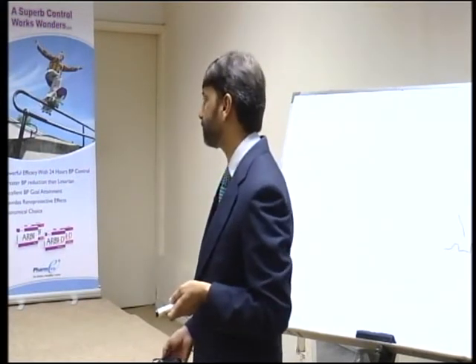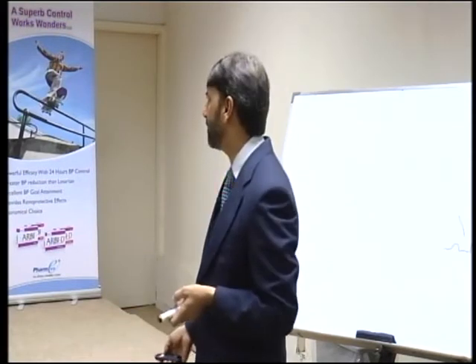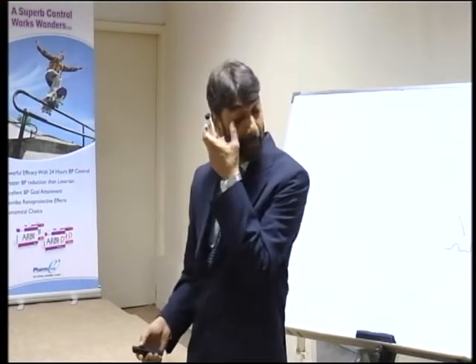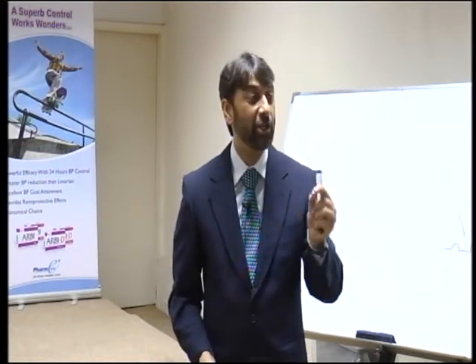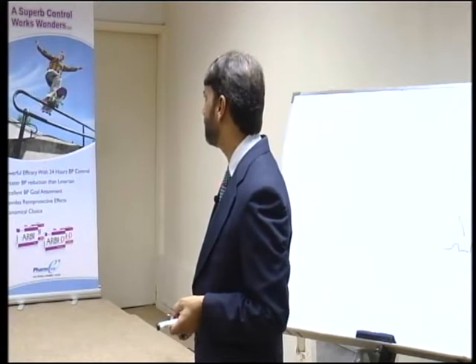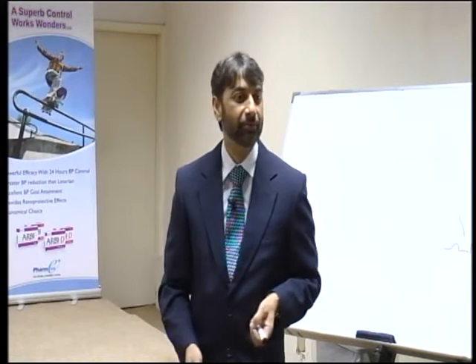Territories you need to know to diagnose MI. ST depression, again the same principle, the J point, and then look at these things. We don't spend much time on this. Similarly, just go through this ECG and give me the answer regarding ST depression. How much ST depression in which leads? 2 to 3 millimeter ST depressions. Here an elevation. Just look at the J point.